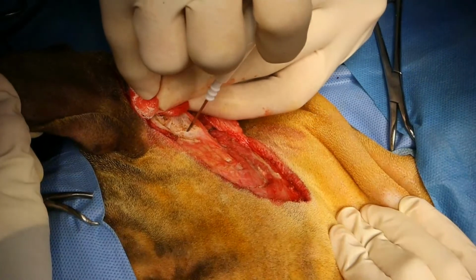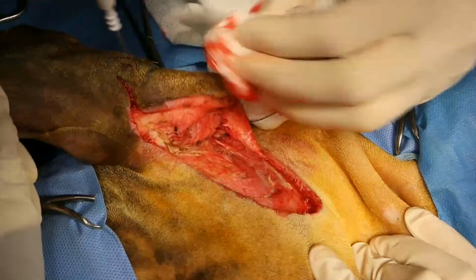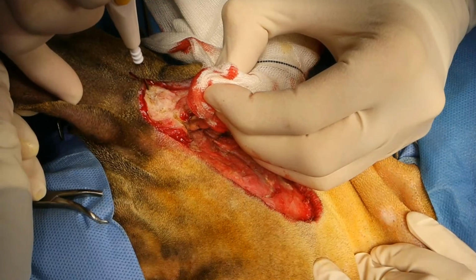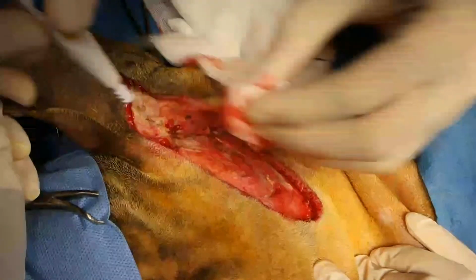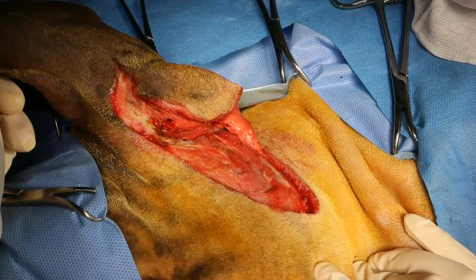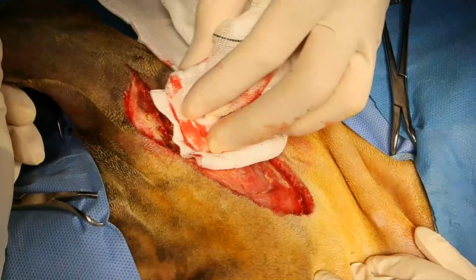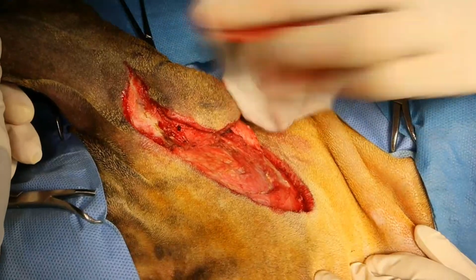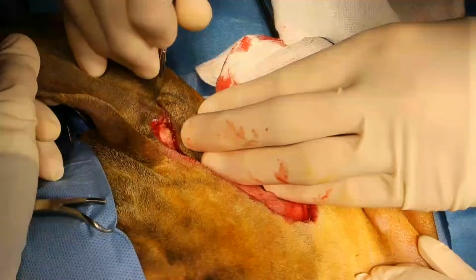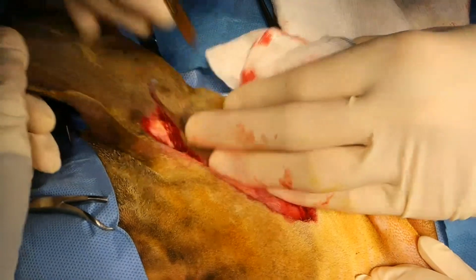Some down to cartilage there. I have had one cat develop necrosis of the pinna after, can I get a number 4 Gelpi, please? After a total ear canal ablation, and that cat did have diabetes, and so I think that it probably had some peripheral vascular disease, which contributed.